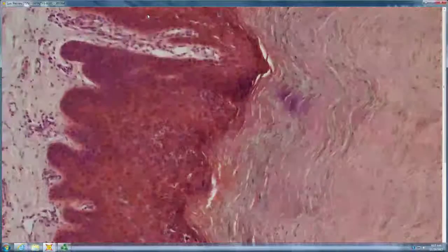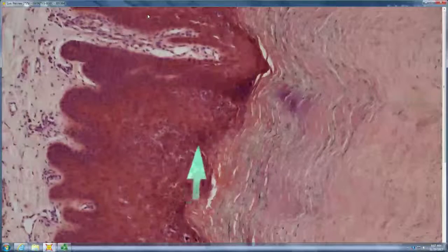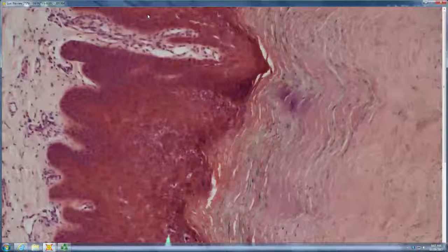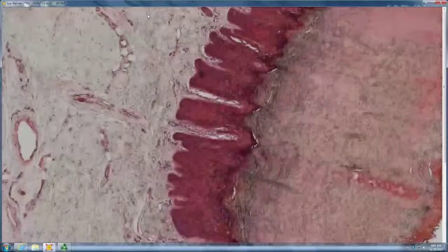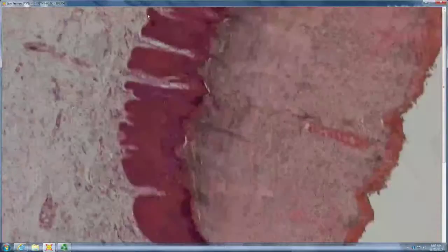A very thick stratum corneum. Very thick stratum corneum. Some acanthosis. Looks like some epidermal lysis. So EHK. So yes. You said hyperkeratosis and epidermolysis, so you flip it around and you got epidermolytic hyperkeratosis.